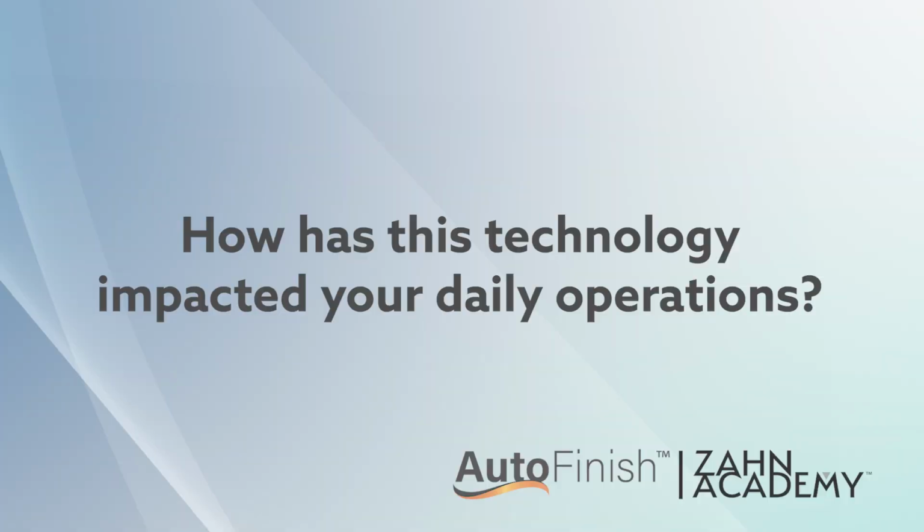Our day-to-day in our zirconia manufacturing has been radically changed. We are now not advertising, but are consistently turning out zirconia crowns in roughly 48 hours. So our cases come in digital or manual, and they're being set up, and that's all the same. Being designed, that's the same. But after they're done being milled, we're doing a little green stain to them, like every lab in North America does. We add a little occlusal stain, and then we have dialed in our zirconia material with our sintering process so well that after sintering, they go right in the polisher, and then they go right to QC.